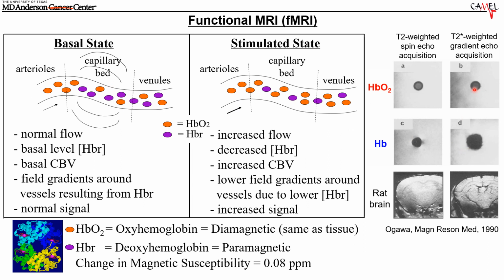That can be seen here where if we have especially a T2 star weighted gradient echo acquisition, which is sensitive to iron, paramagnetic iron, you'll see that it's quite dark. And in fact, there's a blooming effect from that. And because of that, even small amounts of this paramagnetic iron, deoxyhemoglobin, looks dark, and you can pick up structures in the brain quite nicely.